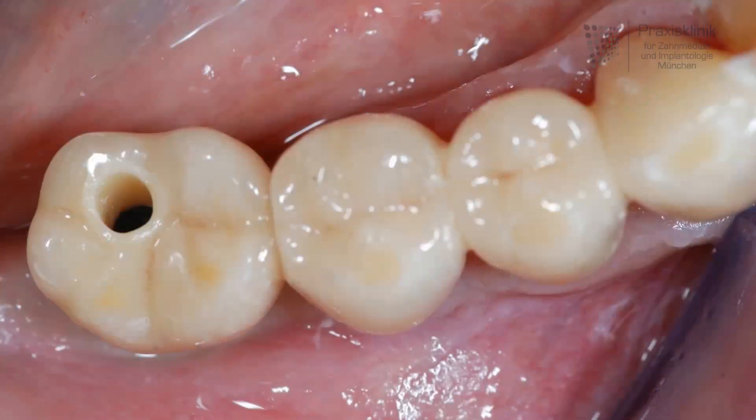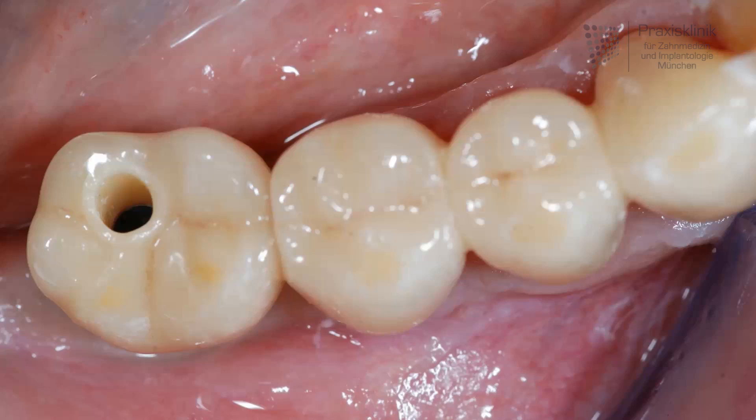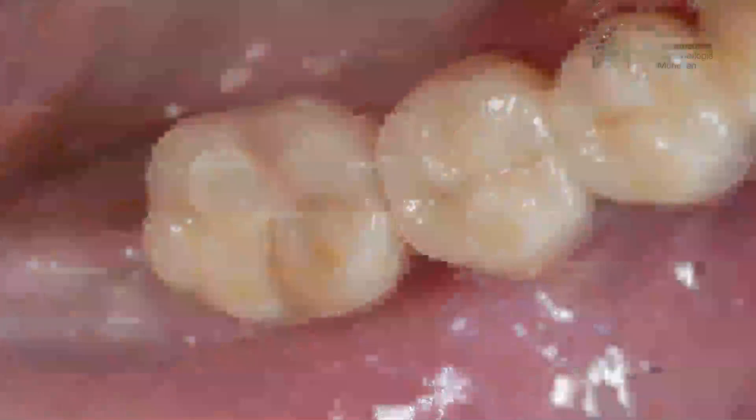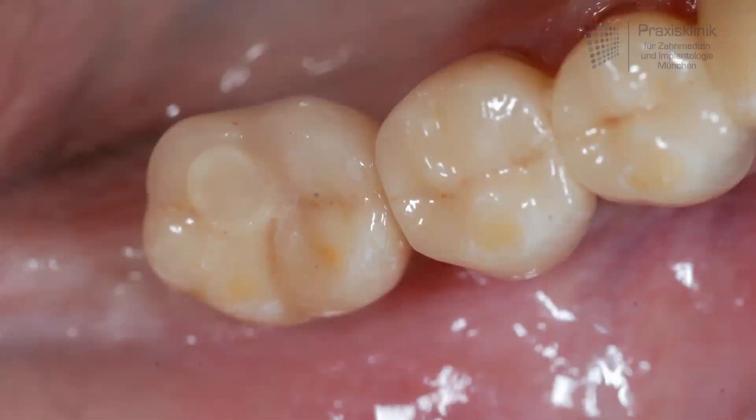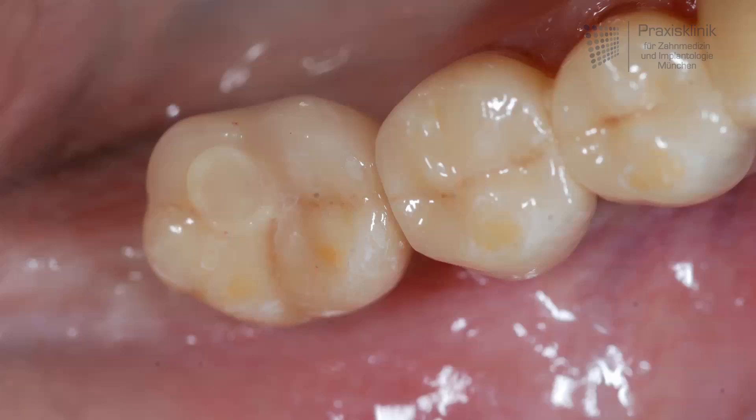As we have a screw retained restoration here, there is a need for closing the access hole to the screw. This can be done by a composite resin material which can be chosen in an appropriate color, polished, and after that the access hole is almost invisible.